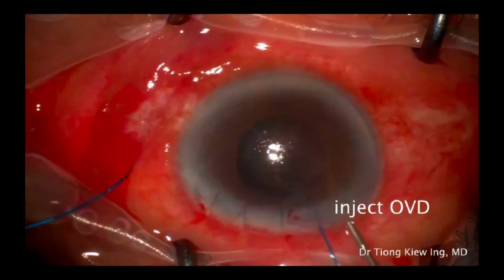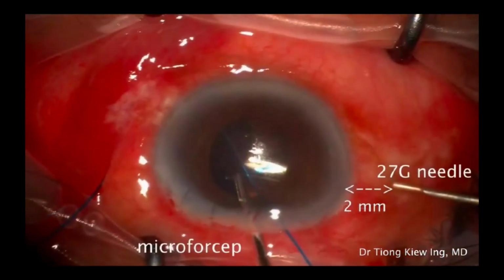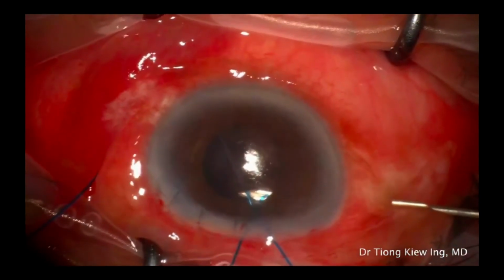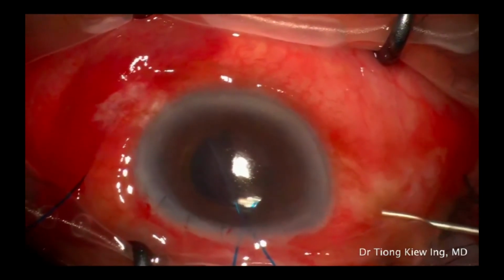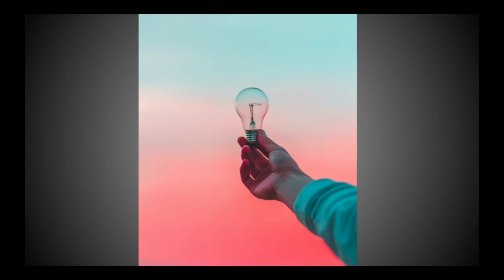The extra point I have learned from this case is to make sure the eyeball is firm enough, either with the help of the OVD or anterior chamber maintainer, so that the sclerotomy can be performed easily. Modified four-flange sclera fixation technique is no doubt an excellent technique which provides a great alternative for sclera fixation, especially for the young ophthalmologists.